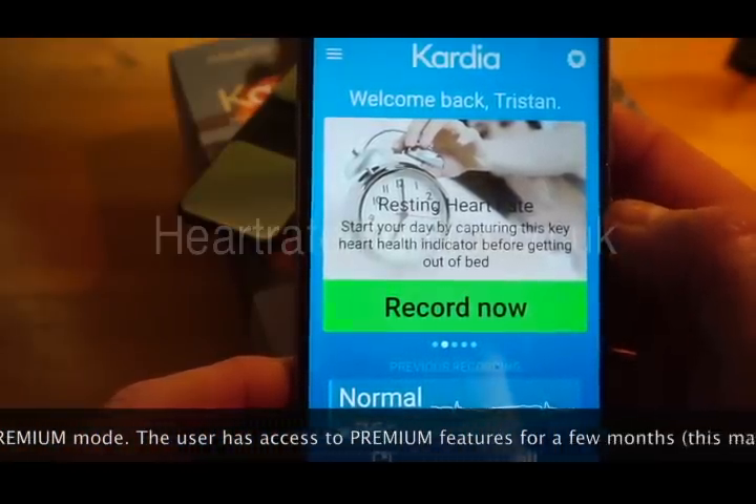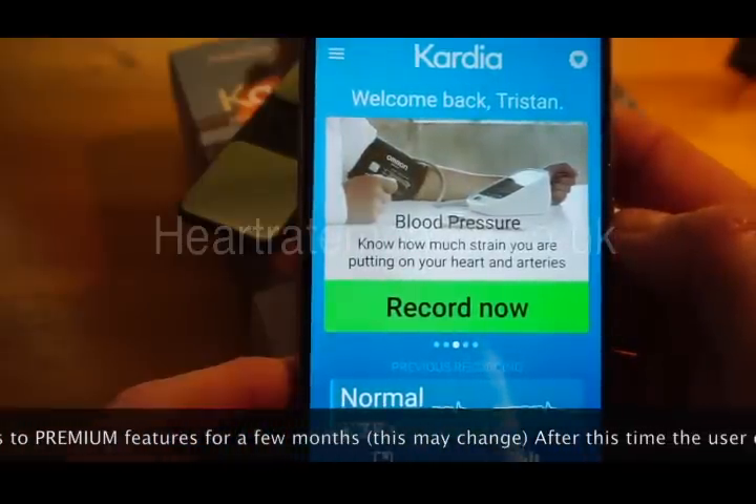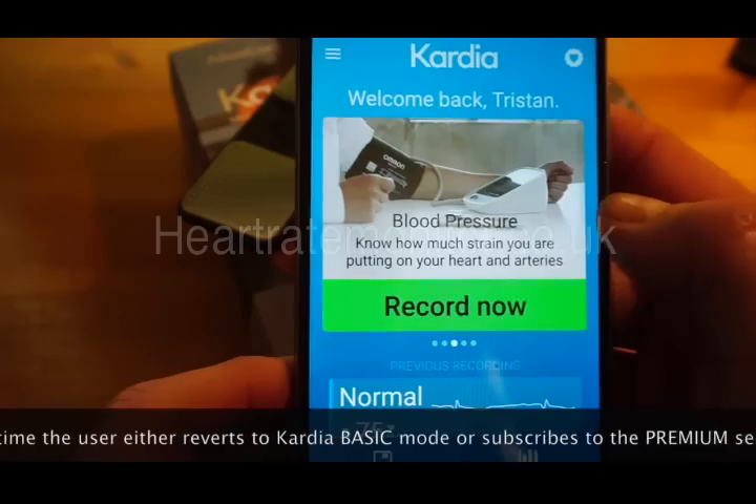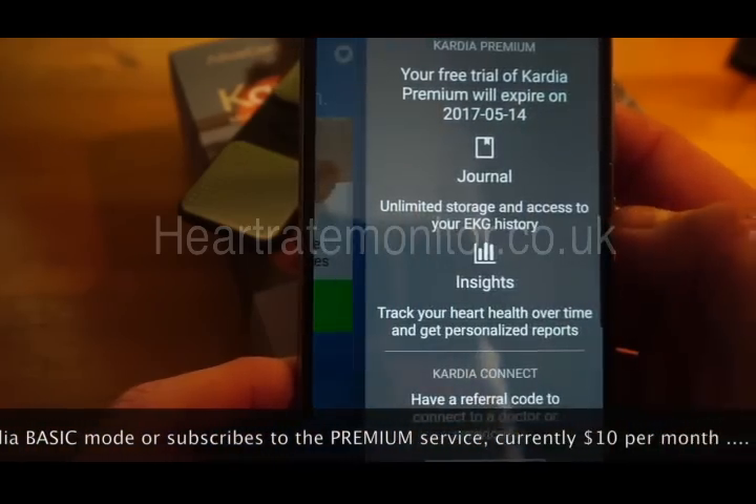So resting heart rate is a useful thing to measure. The device is also compatible with certain Omron blood pressure meters, which I don't have here.